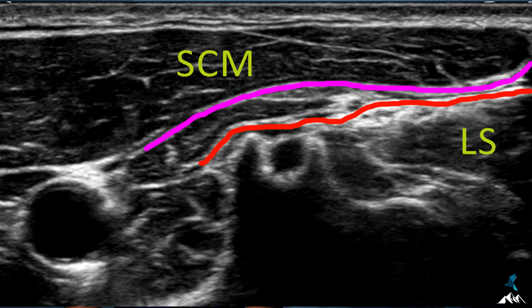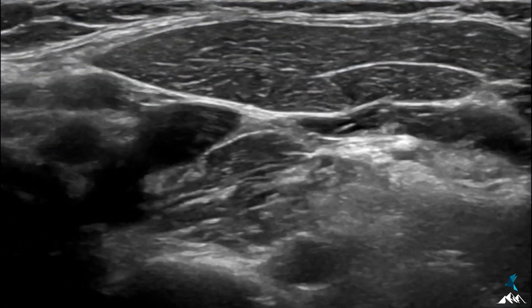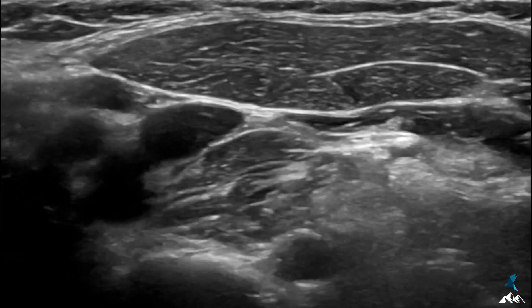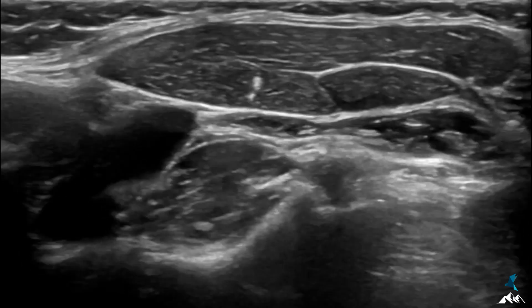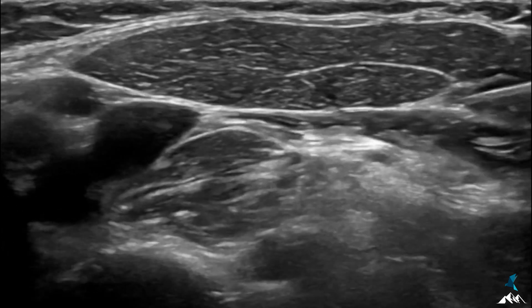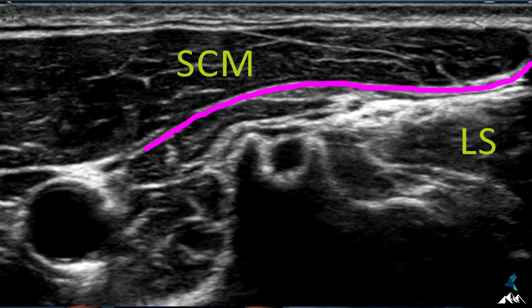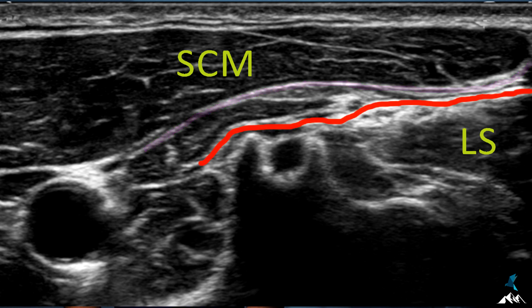We can use an in-plane or out-of-plane technique. In either case, we pierce the skin, subcutaneous tissue, platysma, and the sternocleidomastoid muscle, reaching the area of interest — between the sternocleidomastoid and the levator scapulae, that is between the investing layer and the perivertebral layer of deep cervical fascia. This gives the intermediate cervical plexus block. Any injection superficial to the investing layer or in the subcutaneous plane is a superficial cervical plexus block; any injection deep to the perivertebral layer is a deep cervical plexus block.